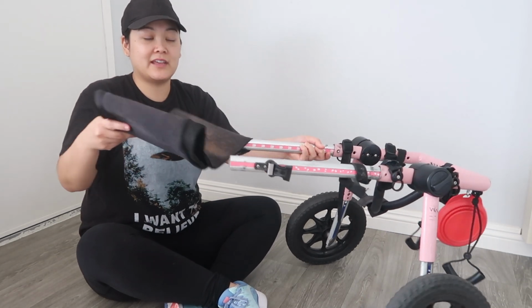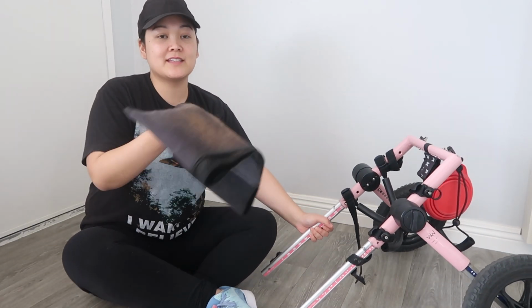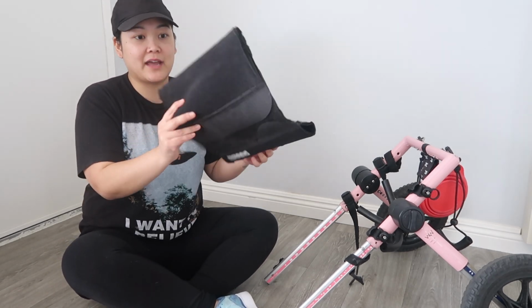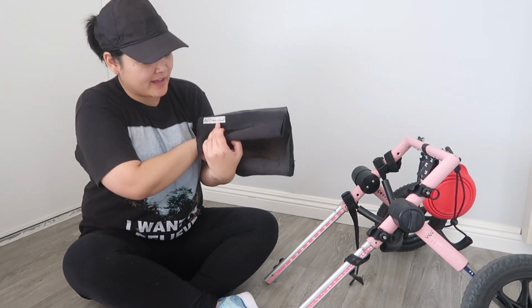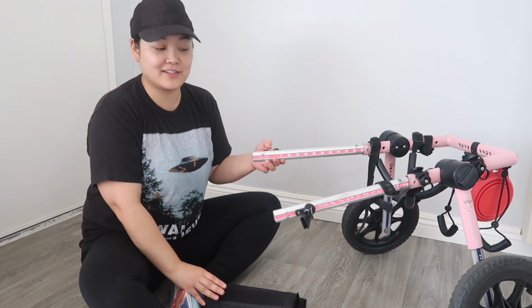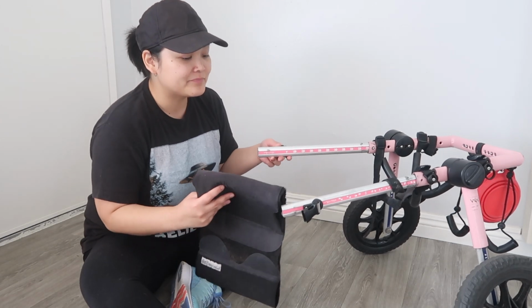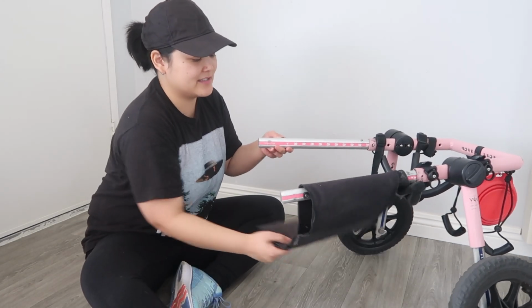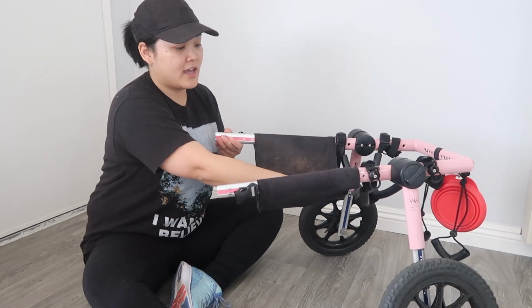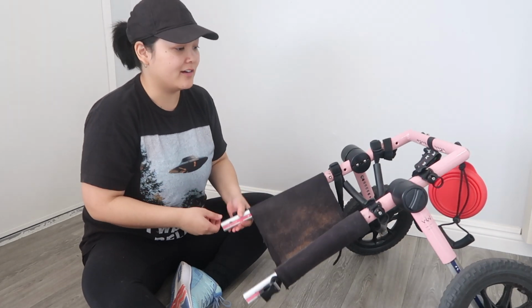So this black part right here doesn't come with the wheelchair. It's just like this. But this is called a belly band, I think. At least that's what I've always called it. This is a belly band, which you can also get, I believe, from the same brand. And this actually helps if your dog's a little chunky like Zoey was in the beginning, and they need that support on their stomach area. That's what this guy is. So it's all hairy from Zoey. So you just slide that on and it adds extra support for their belly. So again, that's if you have kind of a chunky dog like Zoey.